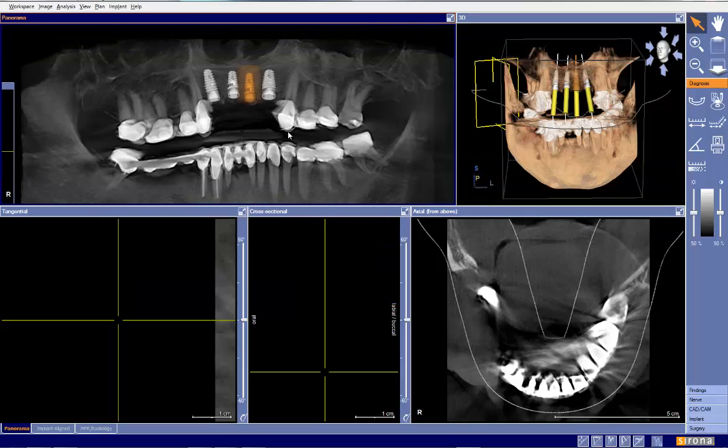So the two ways that we can get tooth data, one is we can do a virtual CEREC wax up, but again, that's going to be predicated on being able to integrate the data, which we have said becomes complicated because we only have one tooth to work with here. Or the more predictable and probably the more ideal solution here would be to have a scanning appliance fabricated with a barium sulfate wax up done.